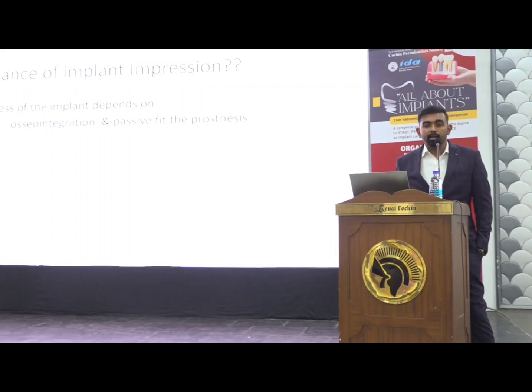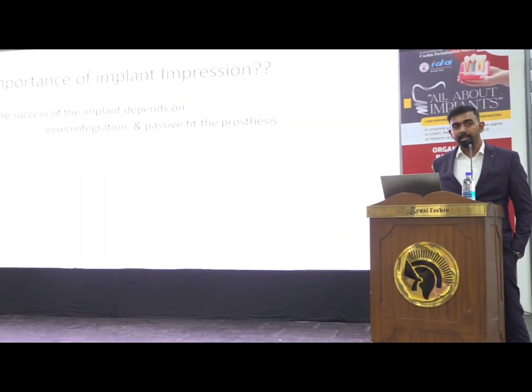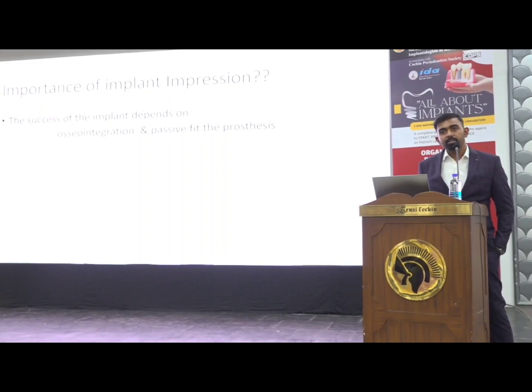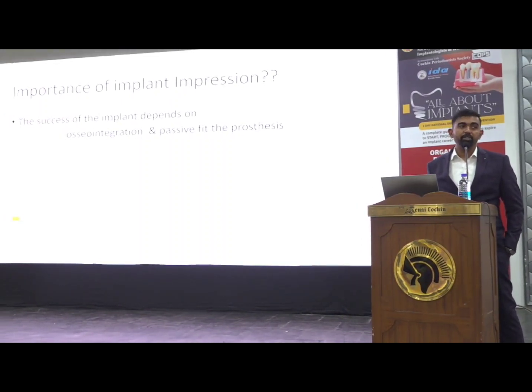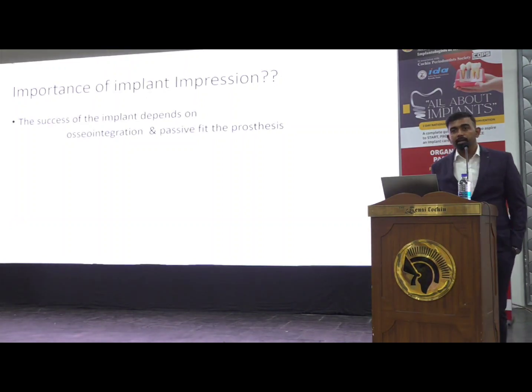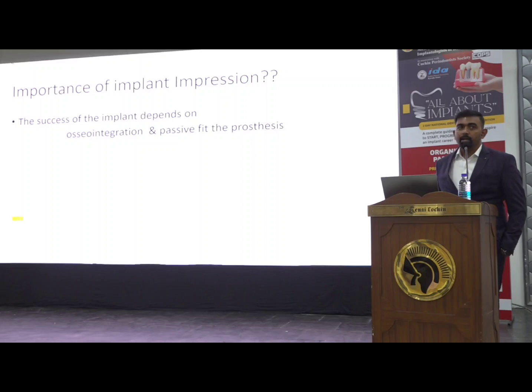The success of an implant depends mainly upon two things. First one is osseointegration, and second one is passive fit of the prosthesis. For a passive fit of the prosthesis, you require a correct impression technique and an accurate impression. Therefore, utmost importance should be given to implant impression techniques.